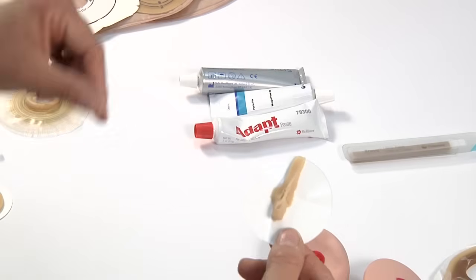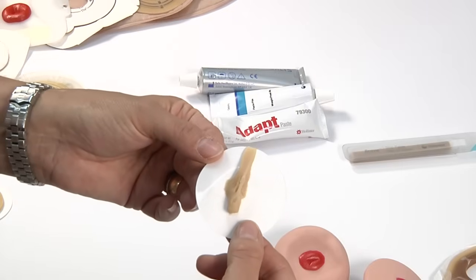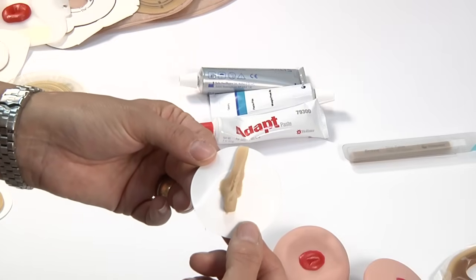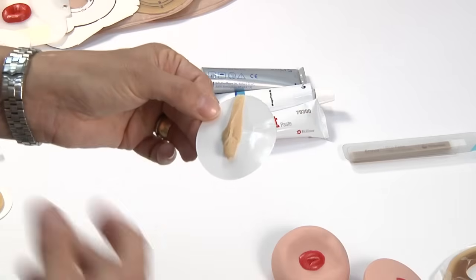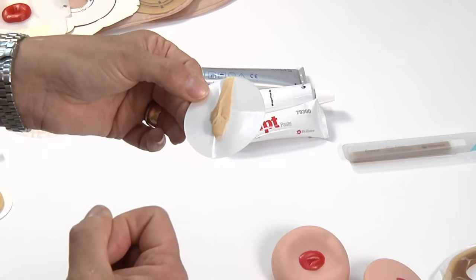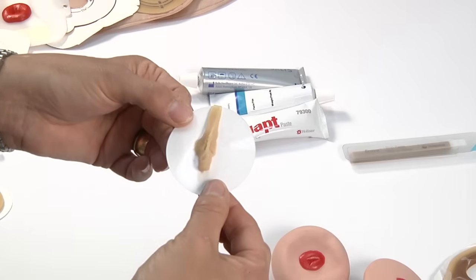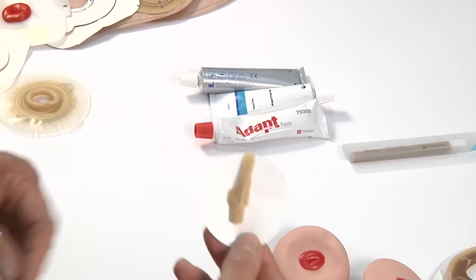All of the barriers actually have similar formulations, and they all have properties or ingredients in them that actually allow for the absorption of moisture. Probably that they would puff up or absorb the moisture, but they also will wash away and erode.